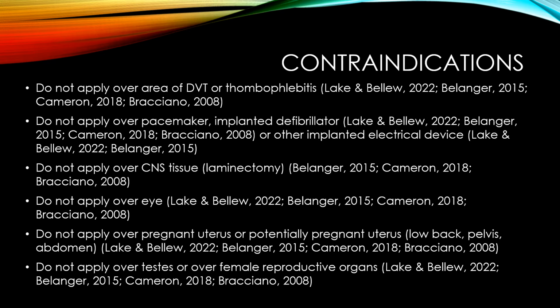Do not apply ultrasound over central nervous system tissue. Now, central nervous system tissue, in most cases and in most people, is covered by bone, so we don't really have to worry about that. However, if somebody had a laminectomy such that there is kind of a little opening or window through which the ultrasound could penetrate to the spinal cord, you would not apply ultrasound in that area.